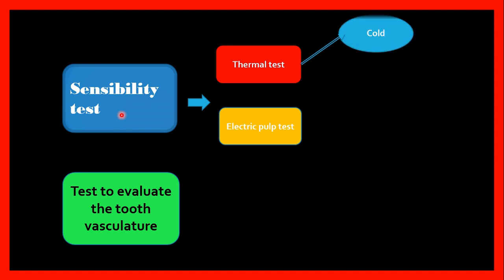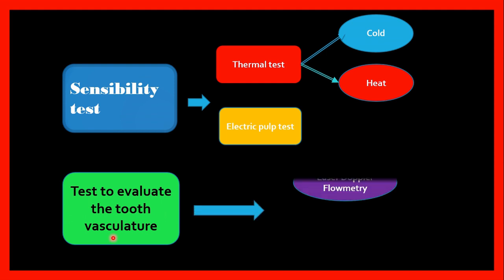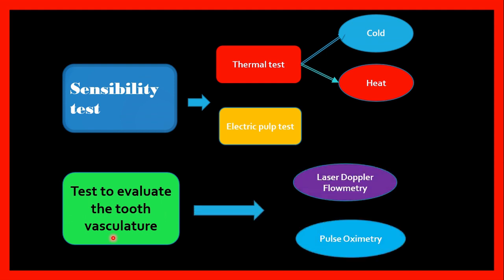Under thermal tests we have the cold test and the heat test, and the tests to evaluate the tooth vasculature include Laser Doppler Flowmetry and Pulse Oximetry.